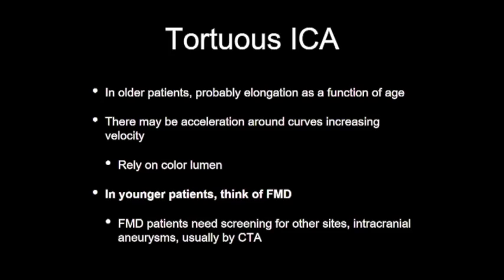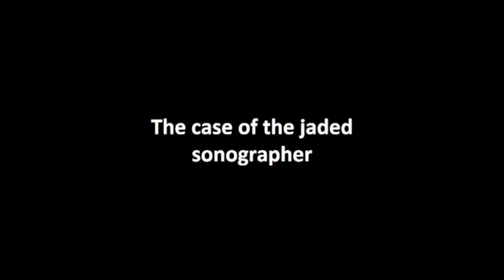Curves will accelerate the velocity, so you have to be careful. Be careful about calling stenosis. Frequently, it's just the fact that there's acceleration. And elongation is very, very common in older patients. So when I see this in the elderly population, which I am getting to moment by moment, then I would probably not worry about FMD and just recognize that it's just the vessels elongating as time goes on. Okay.